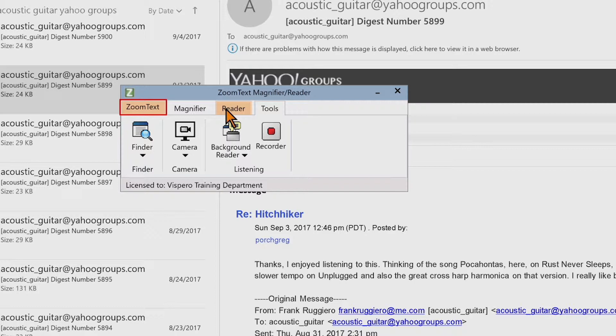The ZoomText toolbar can be minimized or hidden, and restored or made visible again, without affecting the operation of ZoomText. To minimize ZoomText, do one of the following: on the ZoomText title bar click the Minimize button, or while the ZoomText toolbar is active, press Escape.